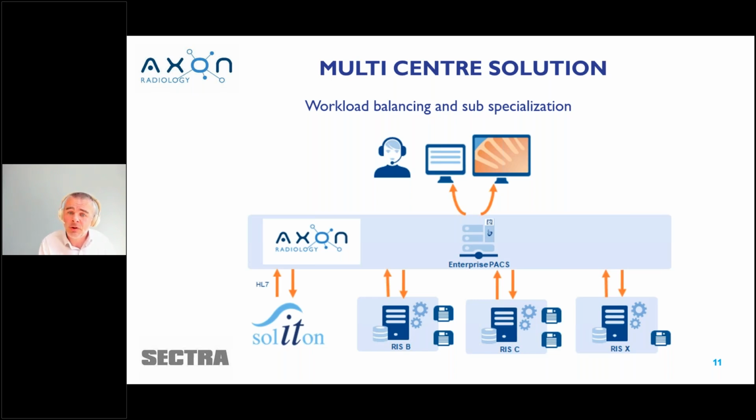Reporting can then be performed within the PACS platform. And as Paul said, the results and reports are automatically orchestrated back into the source RIS, all without any manual administration whatsoever, thus improving quality and increasing efficiency. But of course, and as I say, this does require that the other important stakeholders are involved in that discussion.